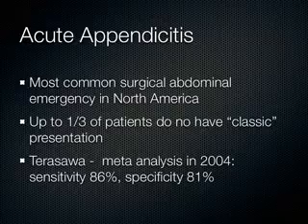Now, going forward in the future, I think ultrasound in the hands of the clinician, the person that's actually evaluating the patient at the bedside and knows exactly where the patient's got the pain, will be better. Sometimes I even hand the probe to the patient. I go, okay, put this where the pain is. And the patient sticks it right where it hurts, and then I push down there, and oh, hey, there's the appendix. The patient found it for me. I think once we see that data start to get out there, the test characteristics will improve. In fact, in other countries where ultrasound is much more accepted in the hands of the clinician, we see incredibly high rates of accuracy with ultrasound for appendicitis.